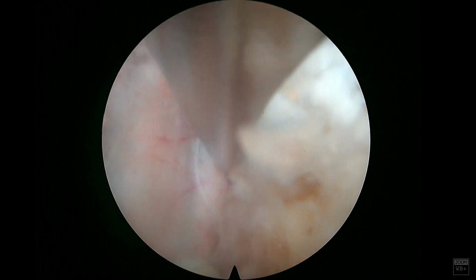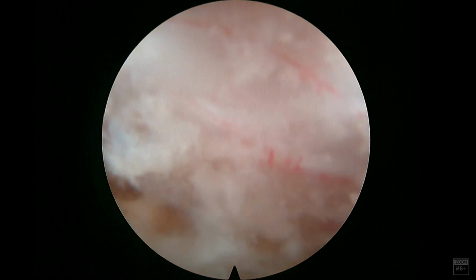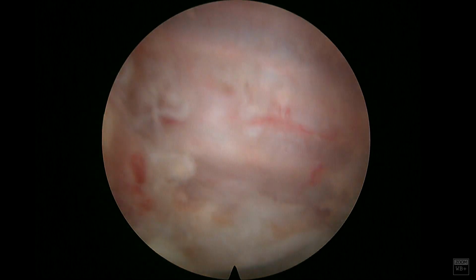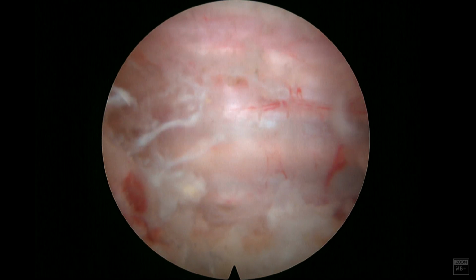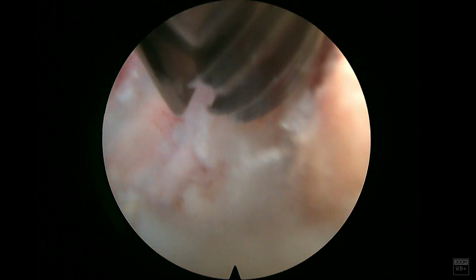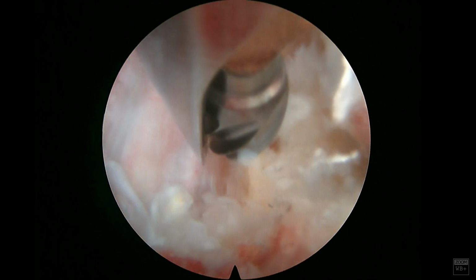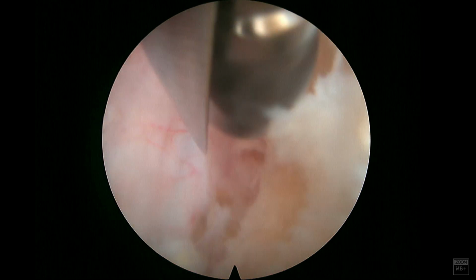So I switch between this and the diamond burr as well as the Kerrisons. I'll use the side cutting burr for really big pieces of bone in the lateral recess. As you can see here, I'm getting a nice decompression with it. Again, I don't want to use this solely for my entire decompression, just due to the risk of dural tear.